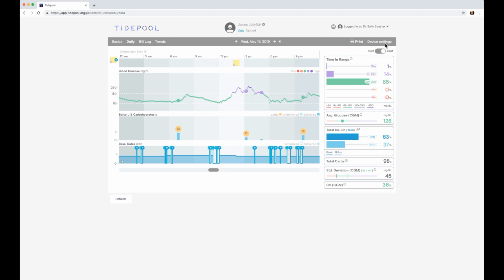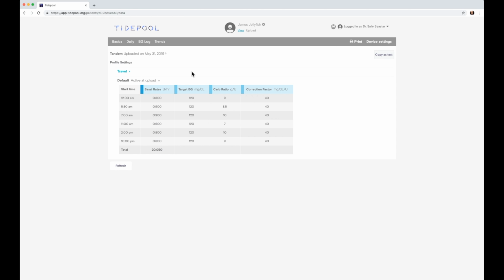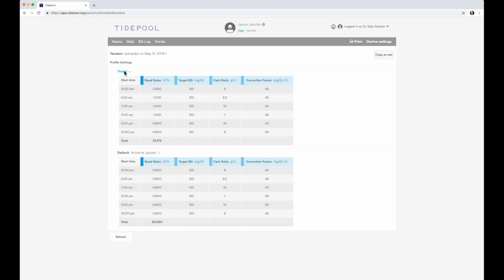Lastly, we have our device settings. This is all data, again, coming off the insulin pump at the last time of upload. We start by leaving the insulin pump profile that was active at the time of upload open. However, you can click through and expand the other insulin pump profiles to see everything that has been programmed into your patient's insulin pump. As previously mentioned, the device settings are included in the PDF printout within Tidepool Web.